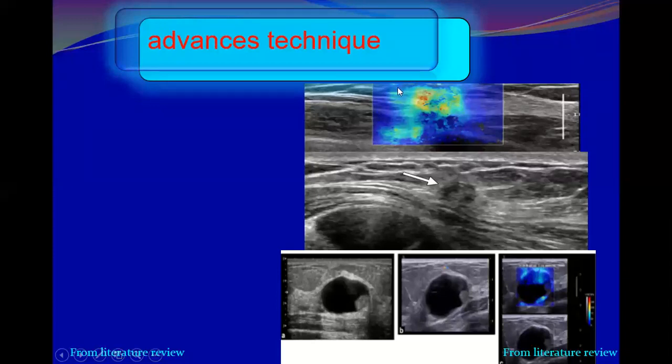It is heterogeneous and larger than here. The desmoplastic reaction we have seen in gray scale is included in the elastography here. That is why, since these are suspicious findings, it goes more with shear wave elastography. Excellent. So this is shear wave.